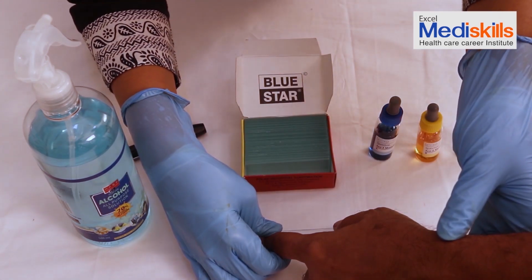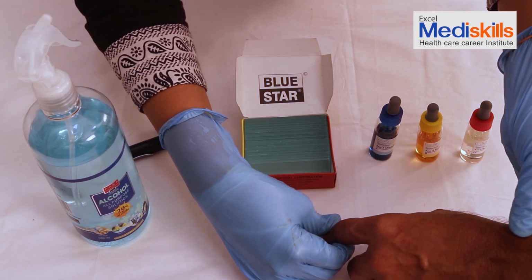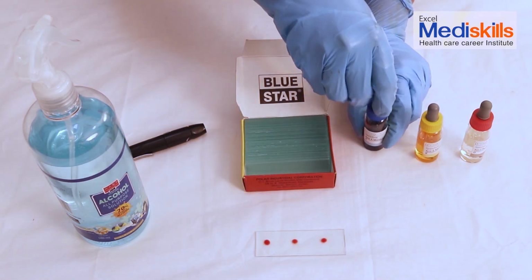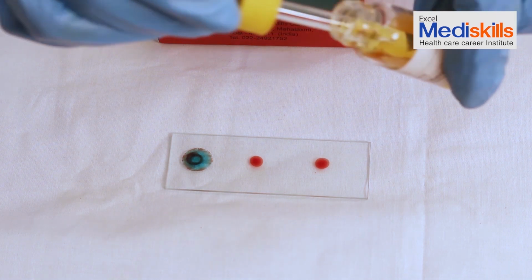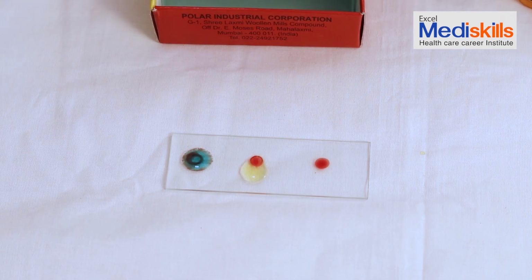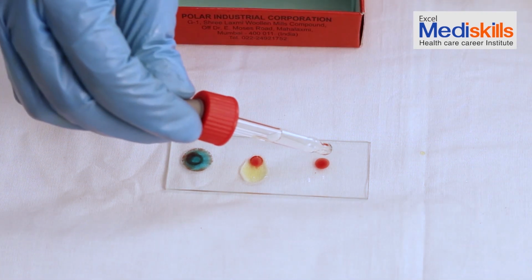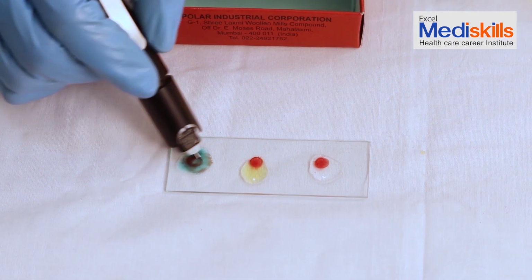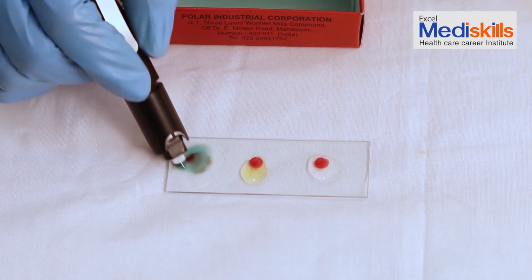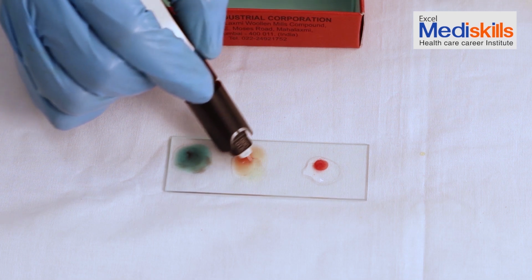After that, we take 3 blood drops on that glass slide. Here on this slide, remember the 3 blood drops should be equidistant from each other. In the first blood drop, we have given solution A. In the second blood drop, we have added solution B. And in the third blood drop, we have added solution D. After adding this, we again mix this with the help of the same needle used while pricking, like this, carefully.